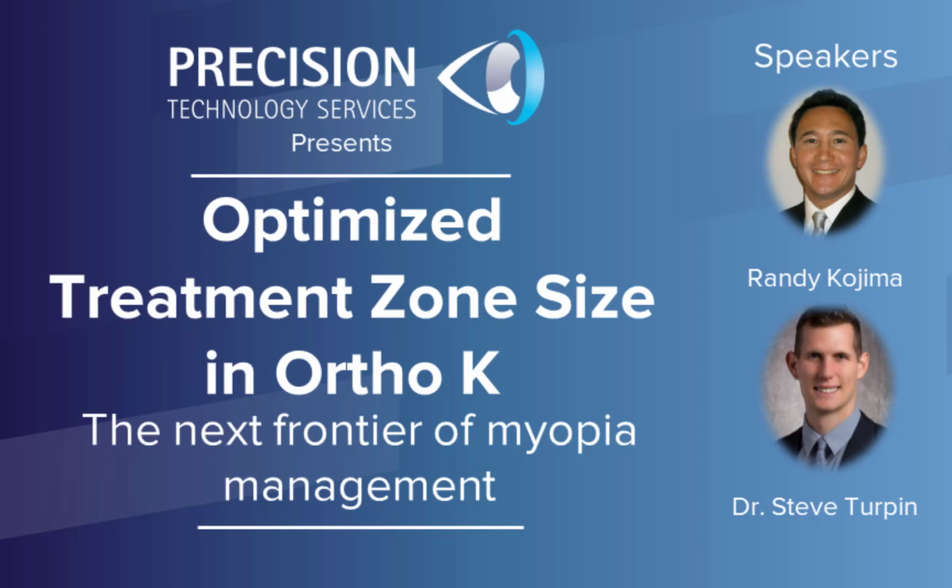I'm Dr. Steve Turpin, General Manager of PTS Optics, and for the first webinar, I got the opportunity to sit down with renowned research and clinical scientist, Randy Kojima. We cover a lot of ground in the lecture, but our main point is to address why shrinking the optical zone size of an Ortho-K lens might increase the myopia management effects and actually slow the axial elongation of patients better than a traditional Ortho-K lens.